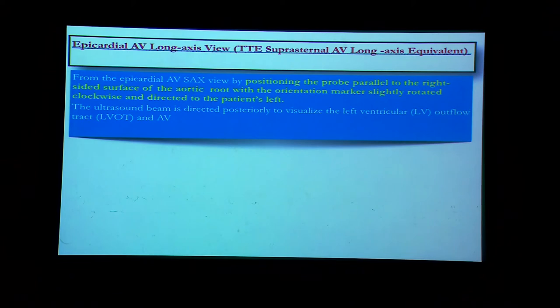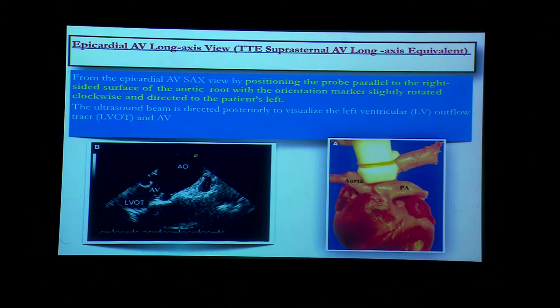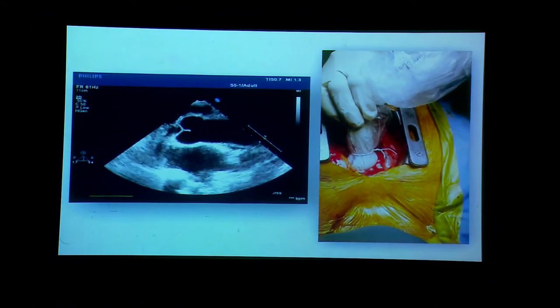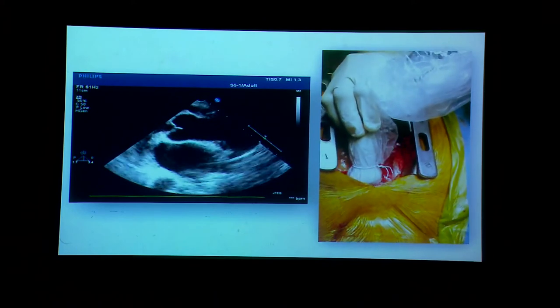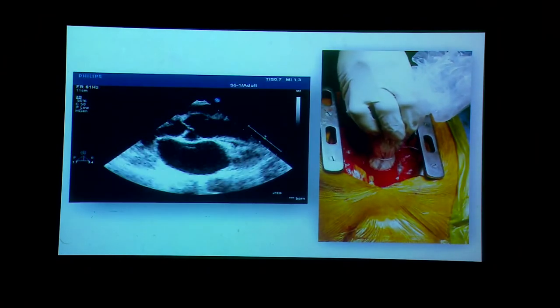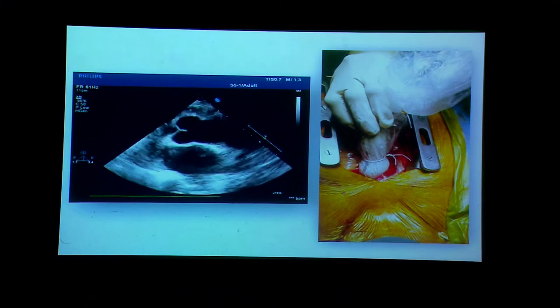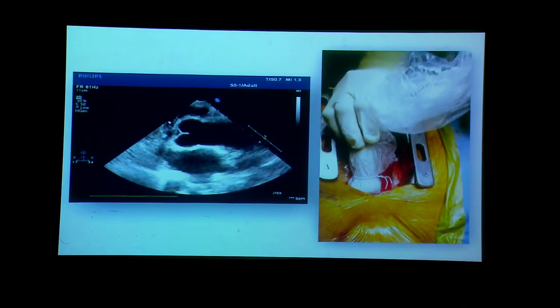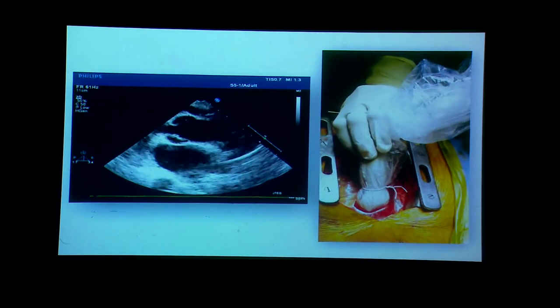From the previous position, we place the probe parallel to the right surface of the aortic root with the orientation marker rotated clockwise towards the left shoulder — this position is used for almost every view except one. From there we obtain the aortic valve long axis view. This is a very important view for measuring the aorta and for understanding atheromatous plaques and calcifications — this view is excellent for evaluating that portion of the aorta.